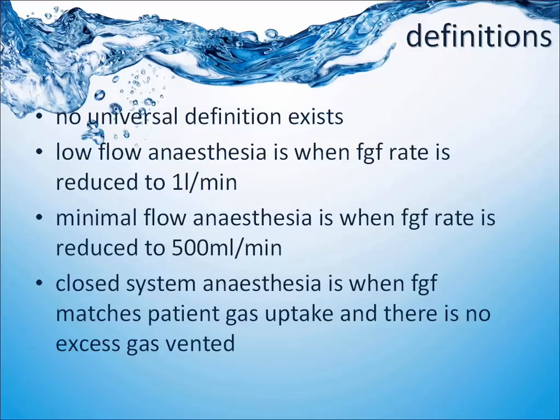The reason why we don't return it back into the circuit is because not all of that aspirated gas is filtered. Certainly when we're connected to a circuit, it's attached to the back end of the filter, but occasionally we attach a nasal prong device to it, or just attach the side port aspirate to a Hudson mask, which is not filtered, and we shouldn't return that to a circuit which another person can then inhale.